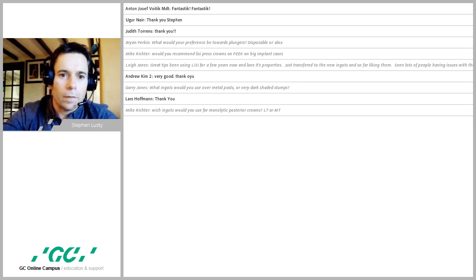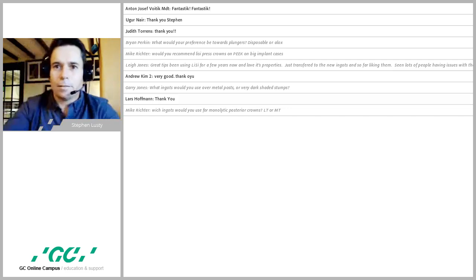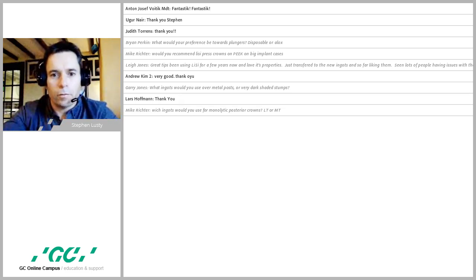And Mike Richter has asked, would you recommend LiSi press crowns on PEEK on big implant cases? Well, really, that's something I don't really do myself. Obviously, possibly Phil Rainton or Lee Mullins would be able to help you with a bit more. That's their sort of thing that they've been doing. For me, it's not really a big thing. I'm not entirely convinced of the bonding to PEEK as yet, so I think I would still stick to doing a composite on PEEK for myself at this point in time.